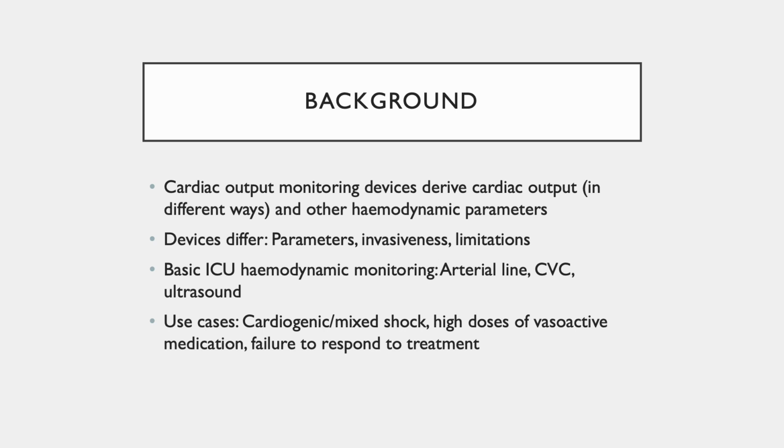Addition of a central line allows for additional parameters like central venous oximetry and the CO2 gap that is discussed in the shock lecture series. Echocardiography is also a useful adjunct, but is non-continuous and operator dependent.